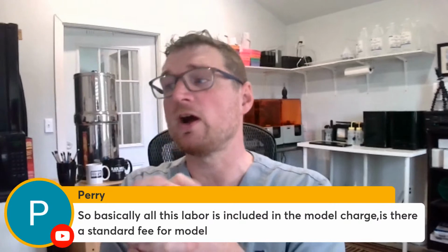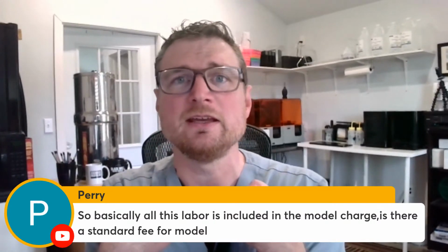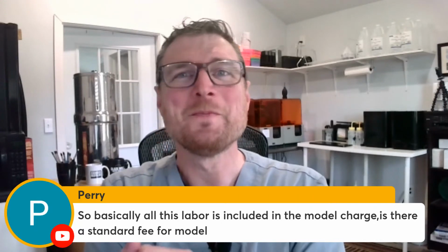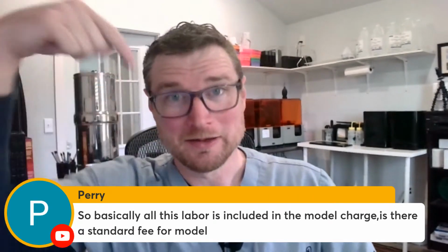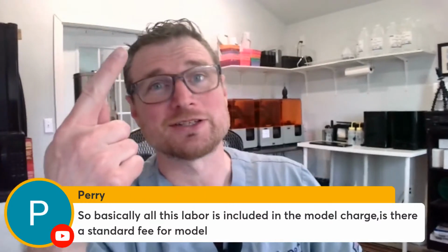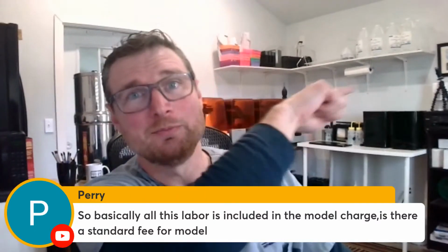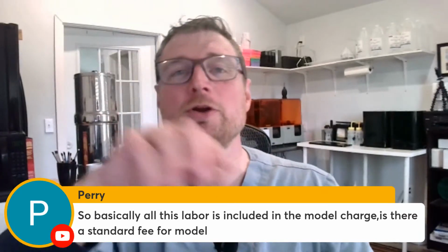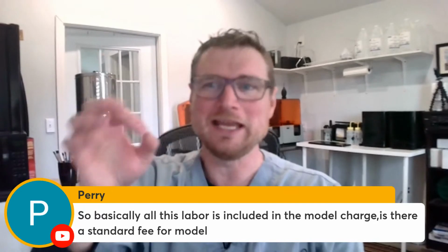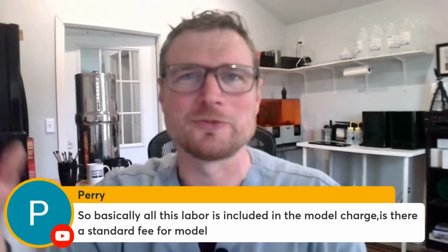There is a standard fee. For my fee, I used to charge $15 a model, and $5 of that was my labor sitting here doing all this. $5 was the cost of the resin, and $5 was the post-production, right? Oh, no, $5 went to the printer payment. So each model went toward the payment for the printer.